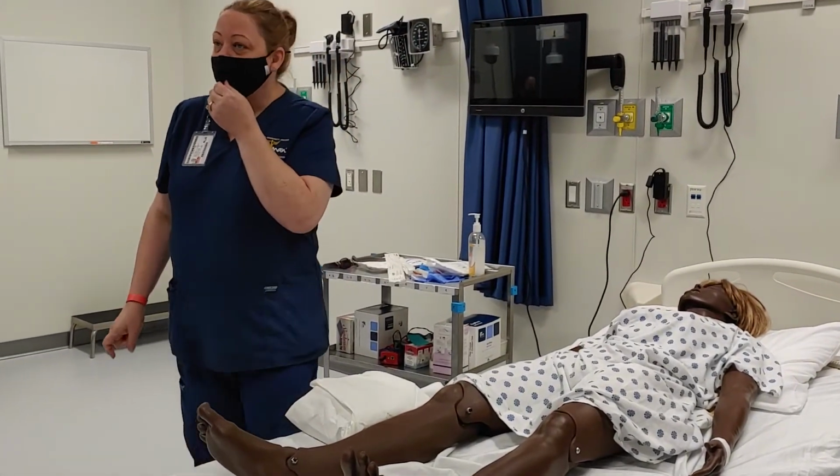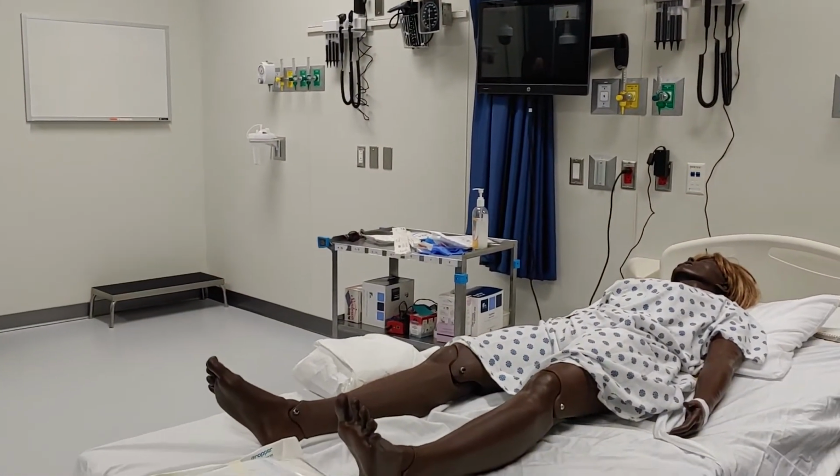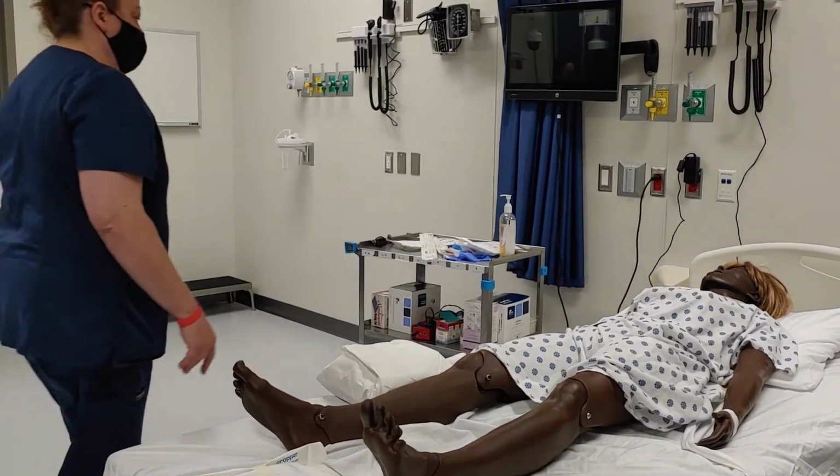Yes? I have a question. So would this be the size you would use in the male? Is this the size you use on the male? It is.